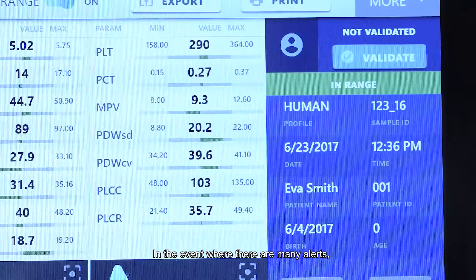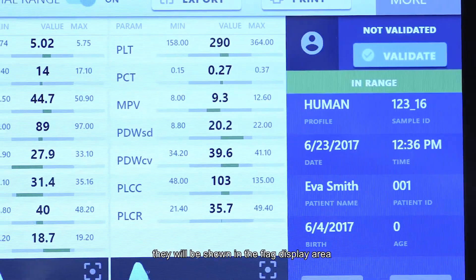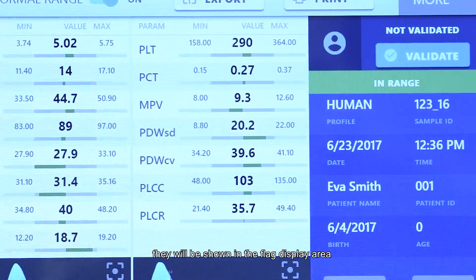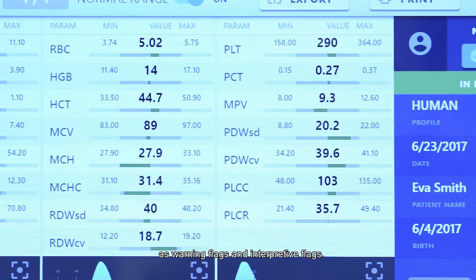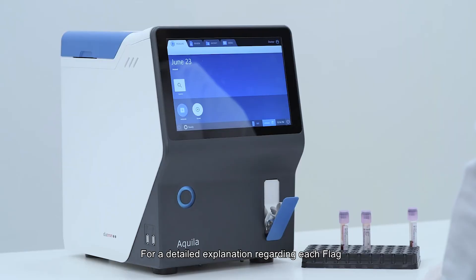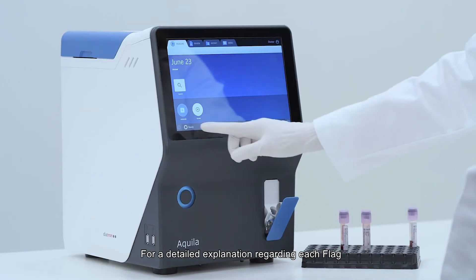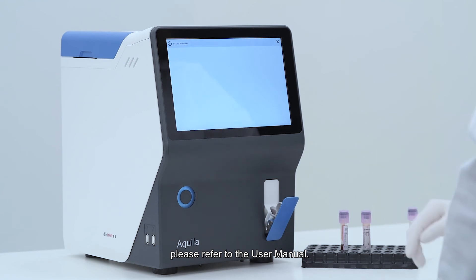In the event where there are many alerts, they will be shown in the flag display area as warning flags and interpretive flags. For a detailed explanation regarding each flag, please refer to the user manual.